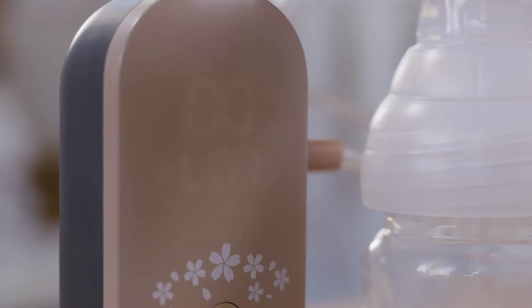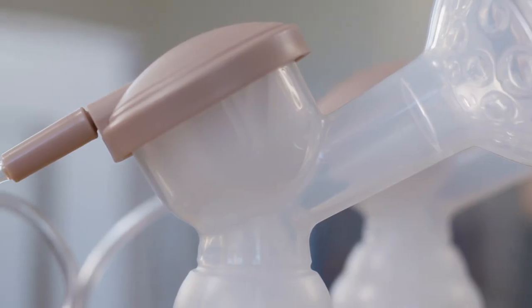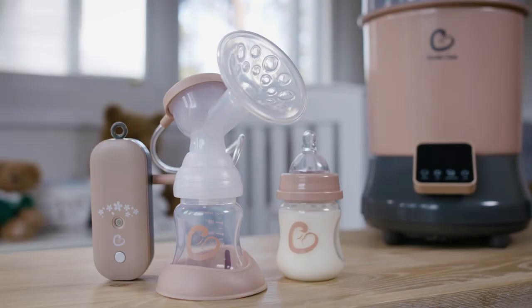The quiet design and night light make this the best electric breast pump to use at night without disturbing your little one. All parts of the electric breast pump that come into direct contact with breast milk are BPA-free, giving you peace of mind.